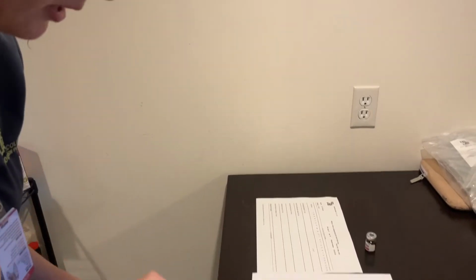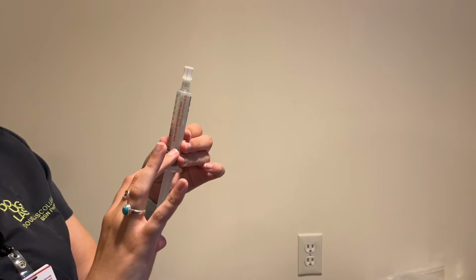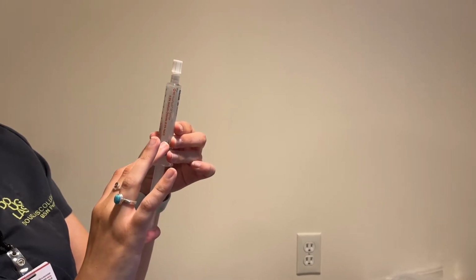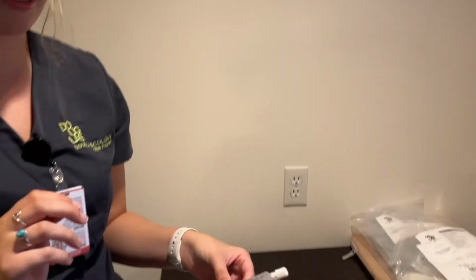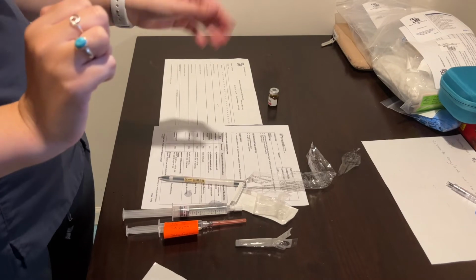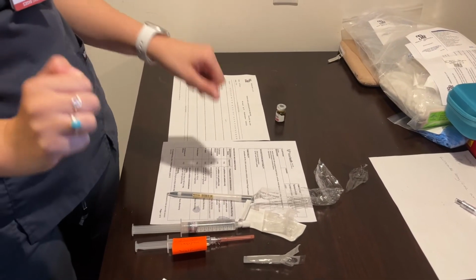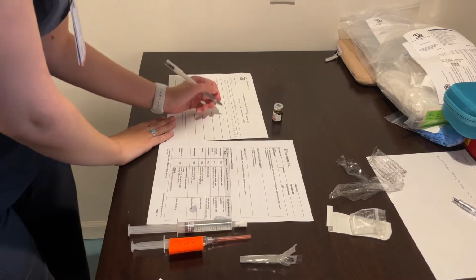My instructor taught me to hit the bubbles so they're up, and then push it up until we see a little fluid. There we go. It is primed and it is ready to go. So I have my IV medication and my flush ready. And my MAR. We're gonna circle the time.